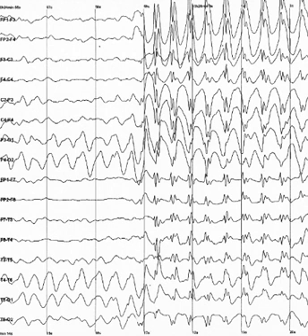The EEG signals, for instance, can be used to detect and track eye movements, which are very important in polysomnography, and also in conventional EEG for assessing possible changes in alertness, drowsiness or sleep.